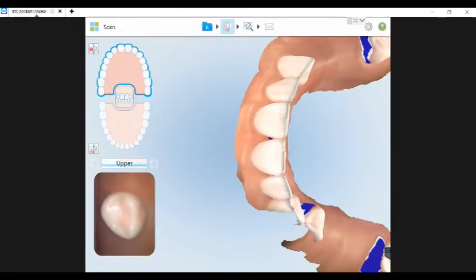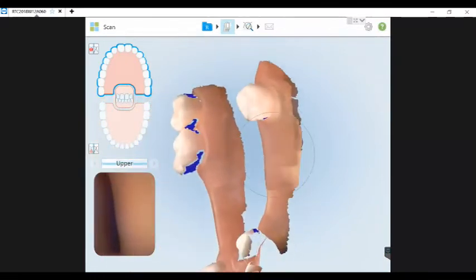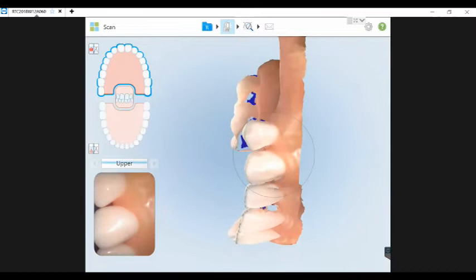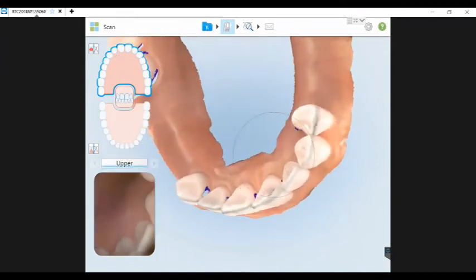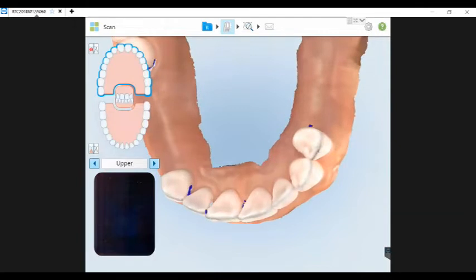What I have found is that when the patient does have a considerable amount of natural dentition remaining, it can be challenging to not capture the lips and cheeks, tongues, and fingers, right? Once you disable AI, and why, so let me back up and explain why you would disable AI.